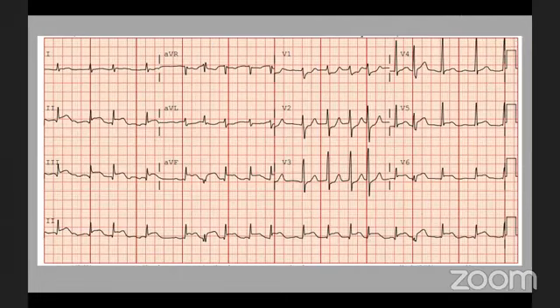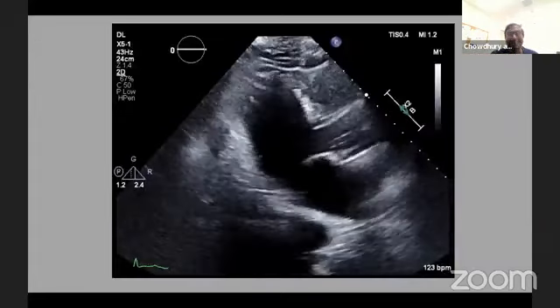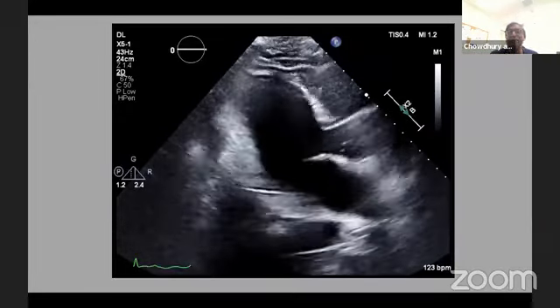Sir, I am for RCA because it seems there is some Wenckebach. Yes. Rofik Bhai is not here. So forget about it, for interventionalists, we look at this very simply. Tachycardia, narrow complex, and then ST elevation, irregular, regular. And move to the cath lab. And I think Rofik Bhai will shoot me.